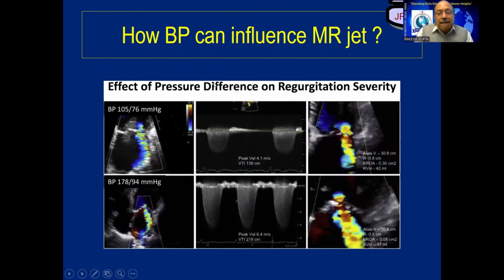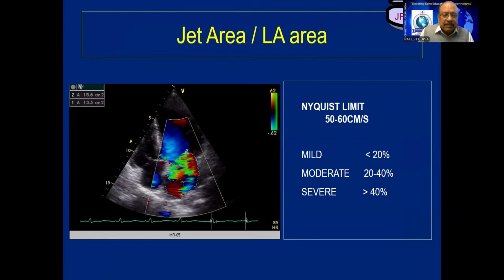All right. Now, MR has to be described as holosystolic, early systolic, mid systolic, or late systolic. If it's a small jet, it's just early systolic. Mid systolic click with MR, always think of mitral prolapse syndrome. Holosystolic is severe MR. And late systolic MR is when? Hypertrophic cardiomyopathy. And that's how we look at the timing of MR with the jets.